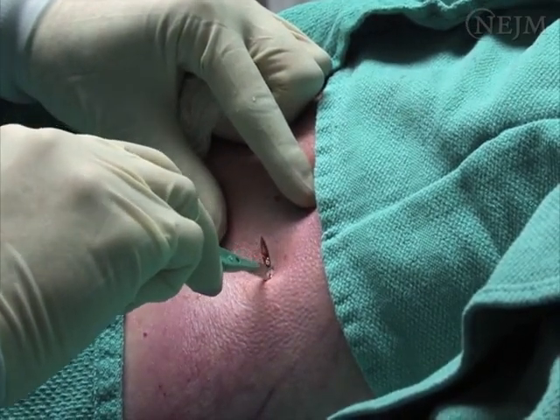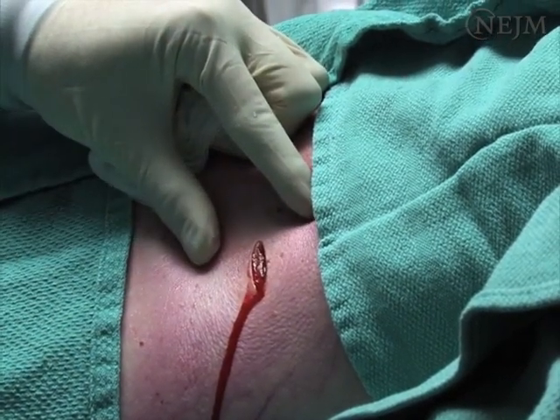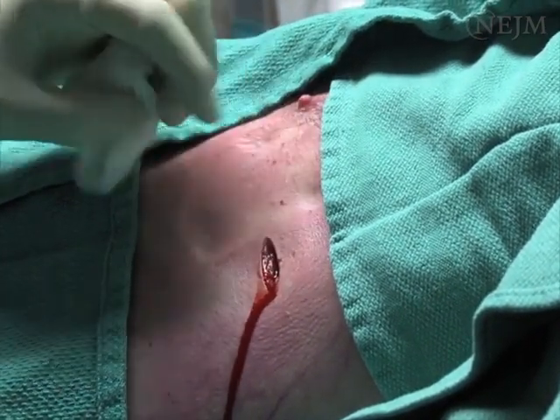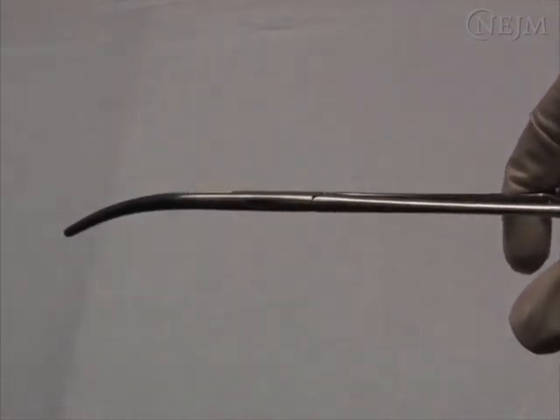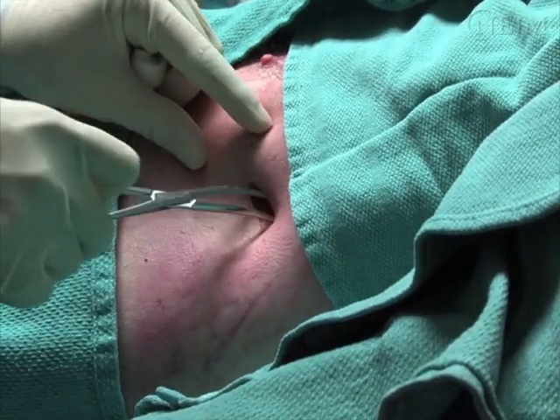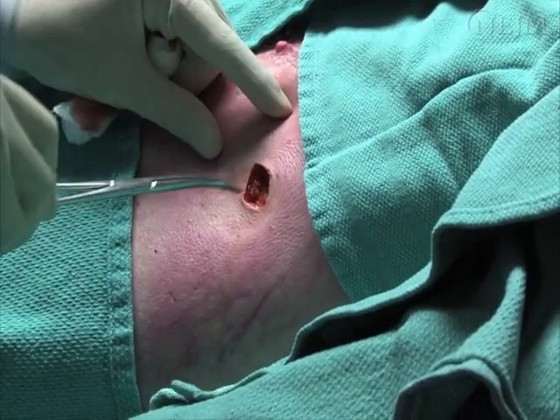Make an incision approximately 1.5 to 2 centimeters in length above and parallel to the anesthetized rib. Introduce the curved dissecting instrument, such as a Kelly clamp, into the incision. Begin dissecting the subcutaneous tissues in order to reach the intercostal muscles.